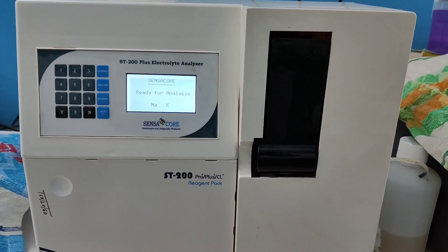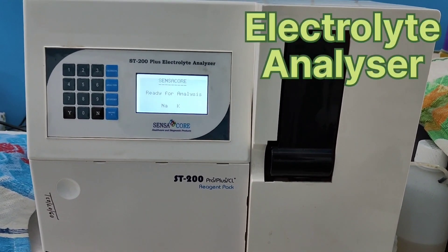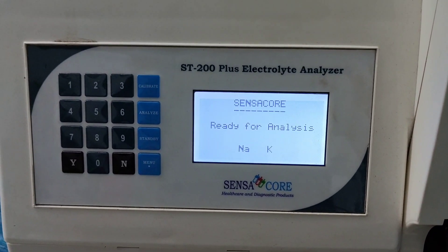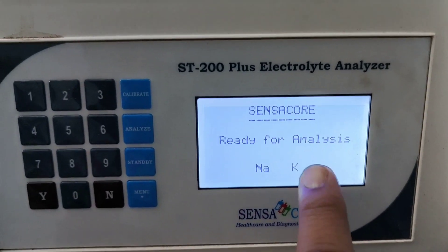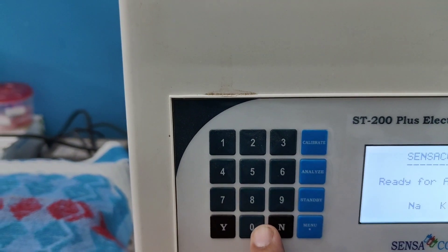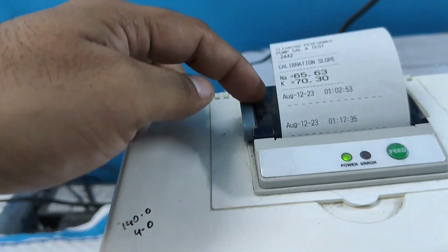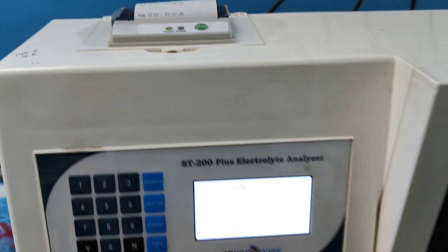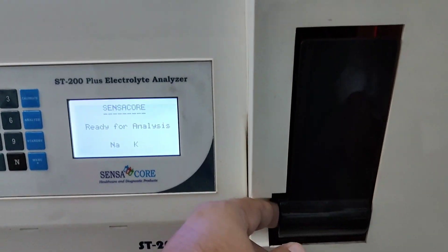Hello friends, this is the Electrolyte Analyzer Sensacore ST200 Plus. This is the display, this is the key, here is the printer, and this one is the sample probe.